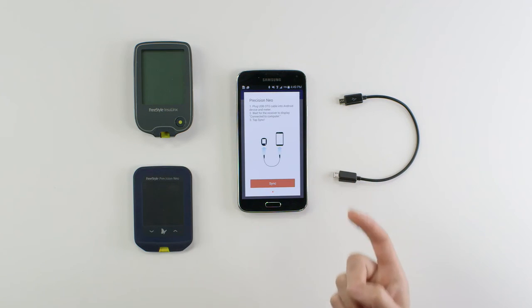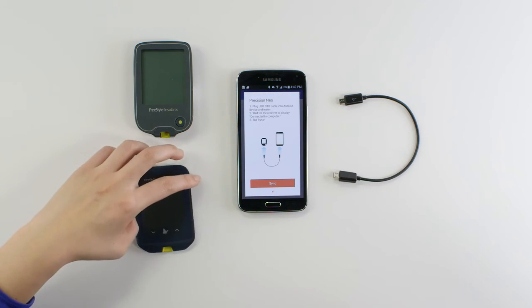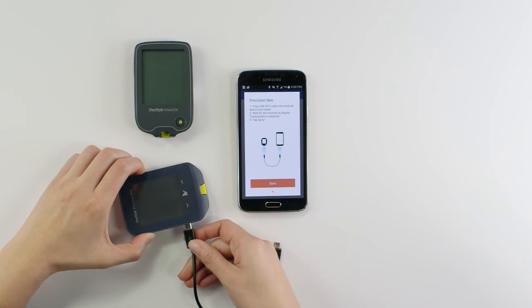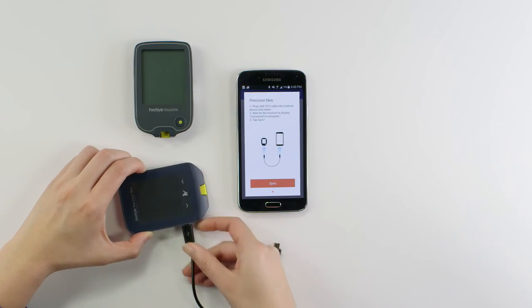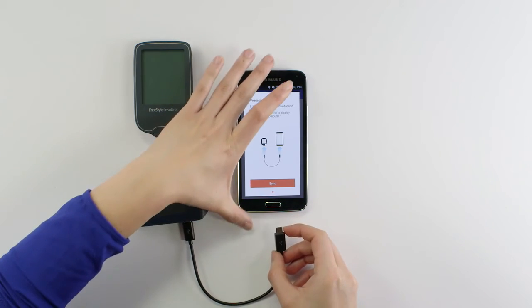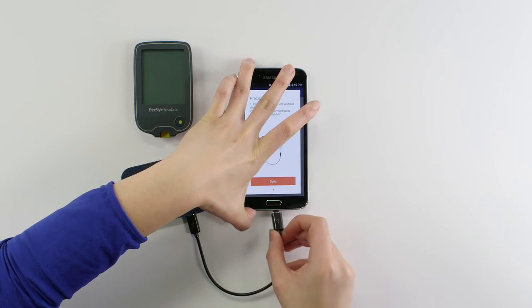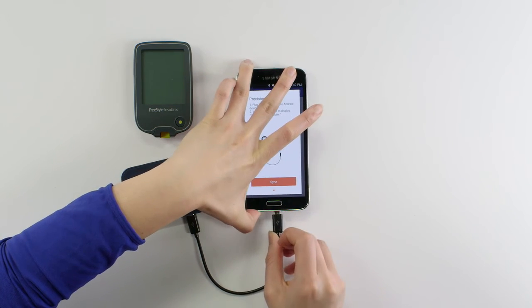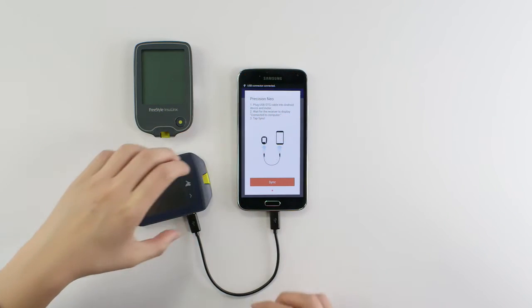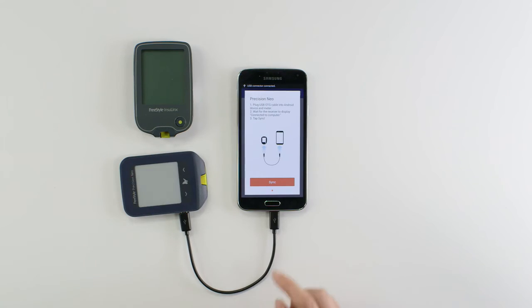Now insert one end of the micro cable into the diabetes device and the other end into the Android device. Tap sync.